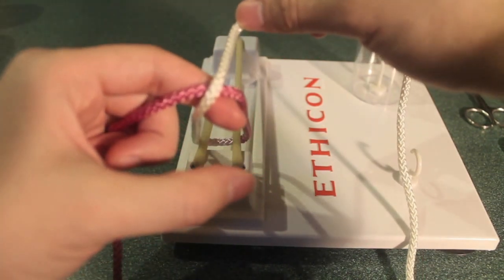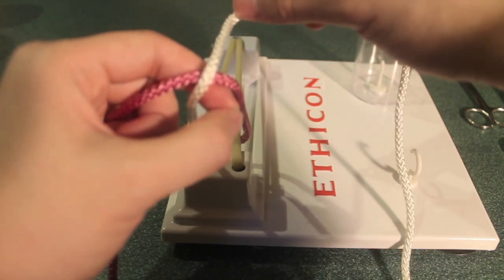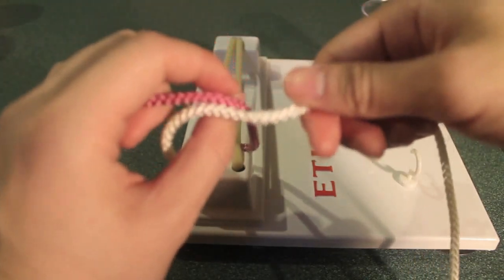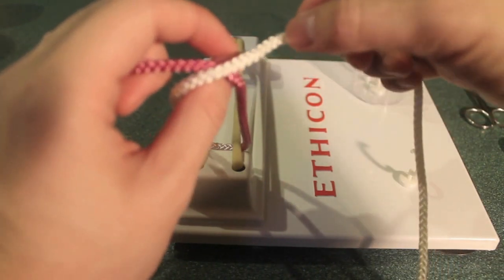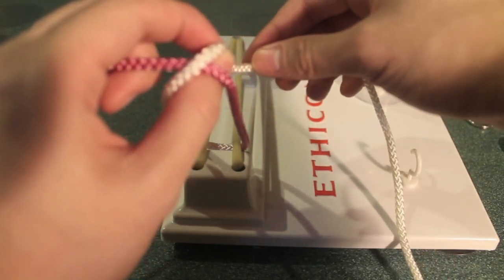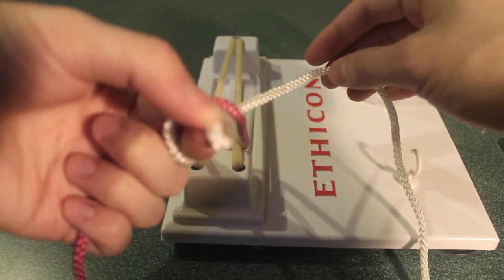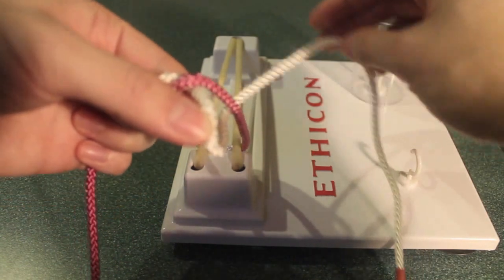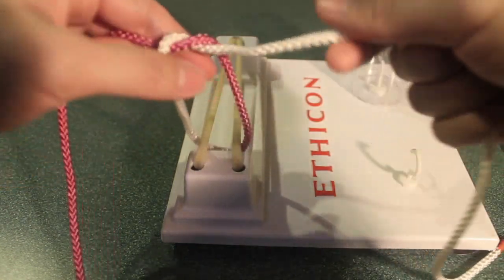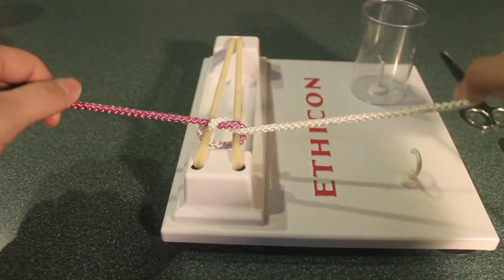To do that, we connect the fourth finger and our thumb in our left hand. Without letting go, we pass those fingers through the loop, and using our right hand, we slip the other end of the suture in between the forefinger and the thumb. Then we pass that end back through the loop towards ourself, and present that to our right hand. We can then grasp the two ends and pull horizontal to secure the first step in our two-handed tie.